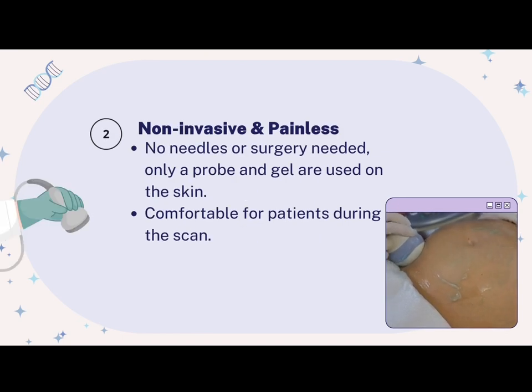Ultrasound is also non-invasive and painless. The procedure only involves placing a small probe on the skin with a layer of gel, so patients feel minimal discomfort. This makes it suitable for quick checkups and emergency situations.